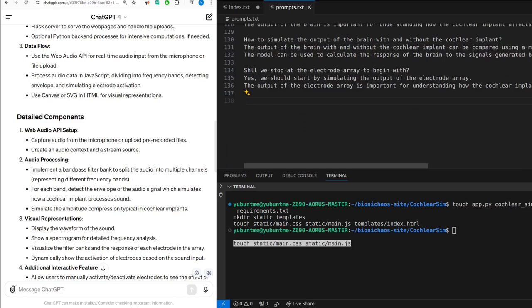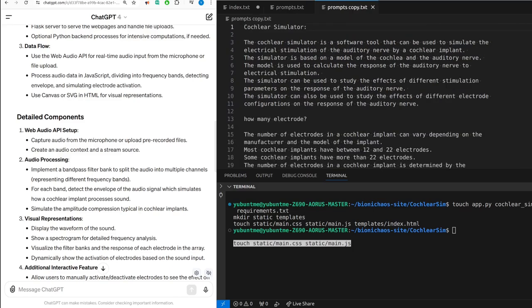Option to synthesize back the audio from the electrode activation patterns requires complex signal processing and synthesis algorithms. 5. Flask server setup: serve the static files and HTML pages. Handle audio file uploads. Optional: if real-time processing in JS isn't feasible for some heavy tasks, implement these in Python and call from JS. Example JavaScript code snippet for audio processing.